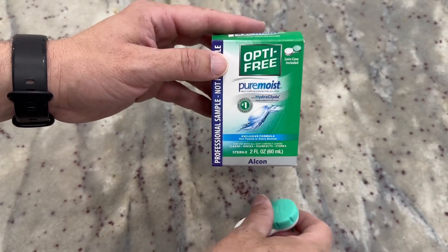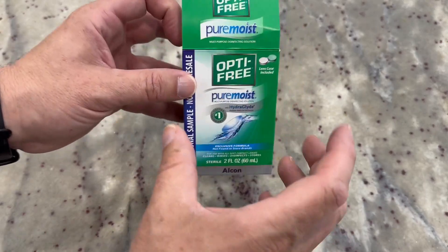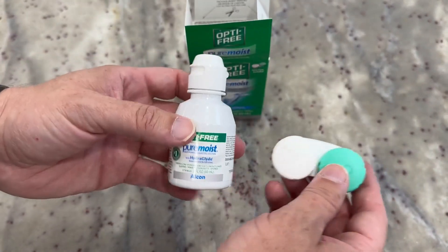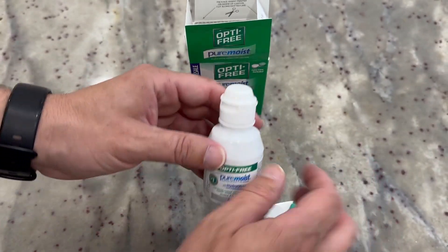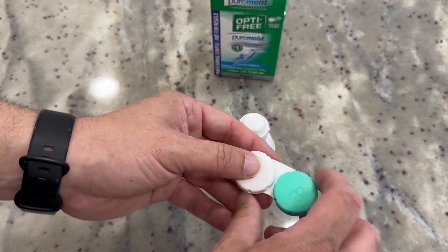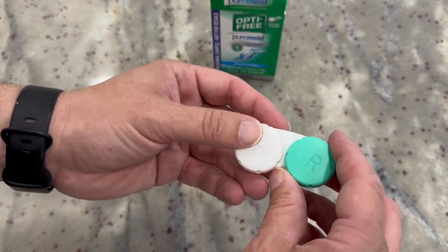This is Optifree Pure Moist. This particular kit comes with your solution as well as a case for your contacts. Some might just be a solution if you're getting a refill, but they recommended this because it kind of helps keep things sterile, clean, and moist.